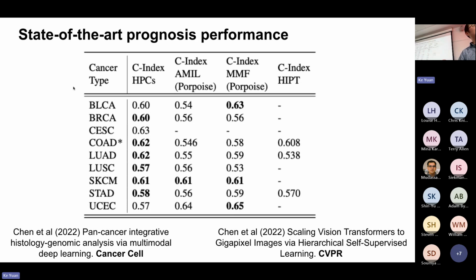So we did some benchmarking of the performance in terms of predicting survival, which is kind of the number one task for those types of images. This was done quite a few years ago, so the methods are already quite old. The newer pathology foundation models were not included in this, but still, to our surprise, at that time the state of the art for summarizing slide-level information is something called multiple instance learning, an already established method in machine learning. It's a very potent correlation extractor, I would say.